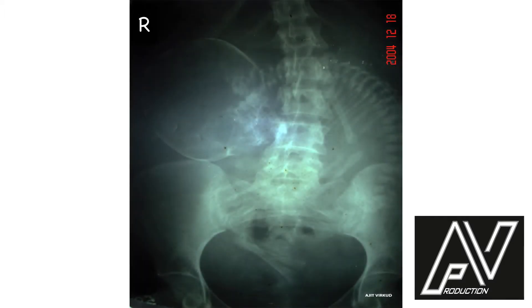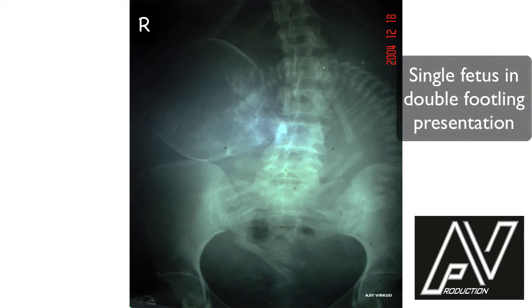This is a plain x-ray of the abdomen and pelvis, AP view, well centralized, well exposed, showing a single fetus in longitudinal lie, flexed attitude. The presentation is breech and the presenting part is double footling. The head is well flexed and there are no obvious fetal skeletal abnormalities. Therefore, my diagnosis is single fetus in double footling breech malpresentation.